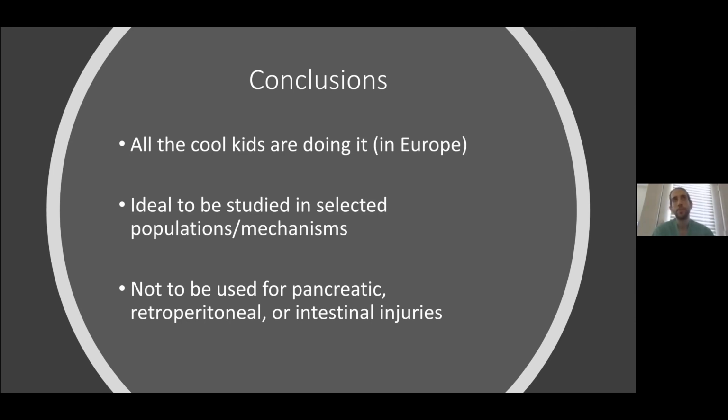And when you're introducing this, it has to be a team approach. So whoever's involved in trauma at your site has to be on board that this is going to be something that you're going to start introducing, or at least studying when it gets to that point. I think at this point in the US, we're still talking about studying and not necessarily introducing it into the clinical setting quite yet.